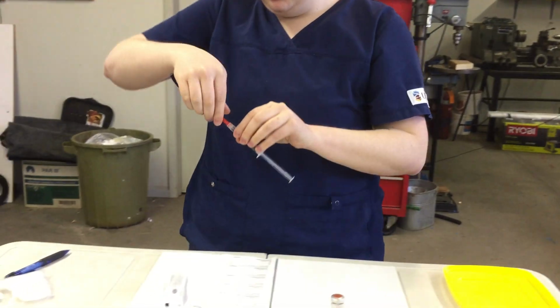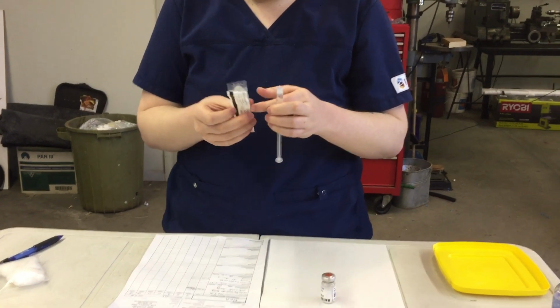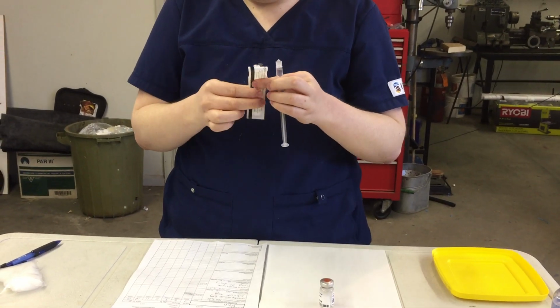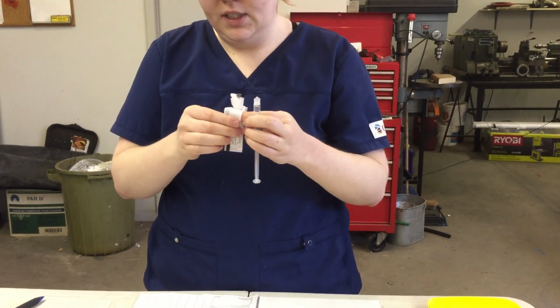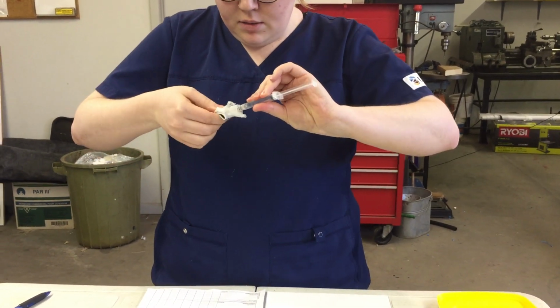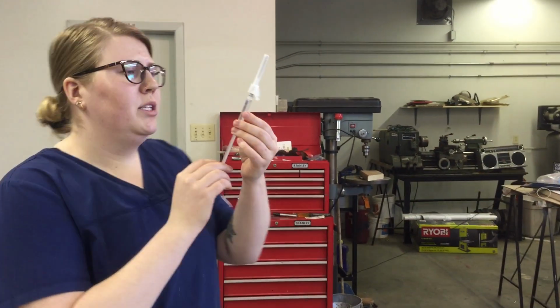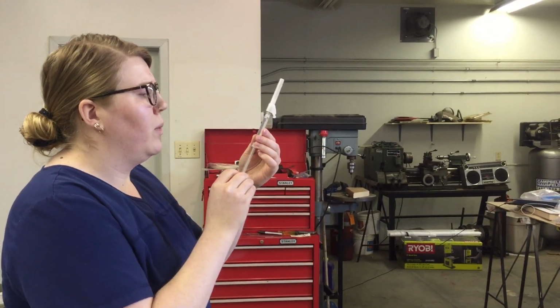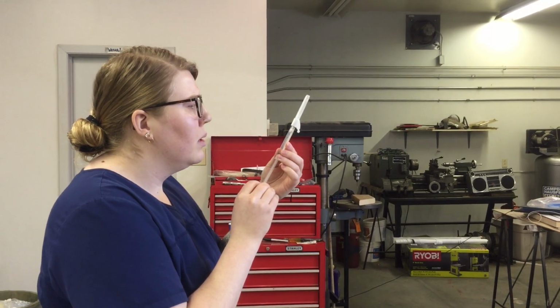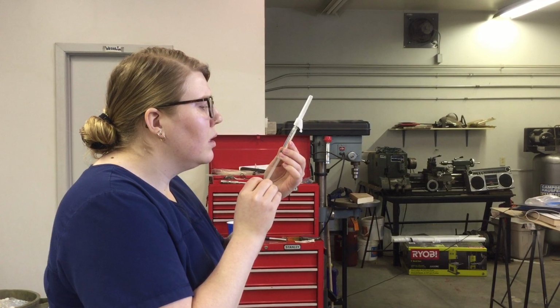So from there, I'm going to remove this. I'm going to dispose of this in the sharps container, and I'm going to open my injection needle, making sure not to break the sterility. Attach that, so I'm going to throw this in the garbage. So at this point, I'm just going to calibrate to the right dose, and I'm going to be doing this over med waste. So I'm going to push up, making sure that we don't have any bubbles.